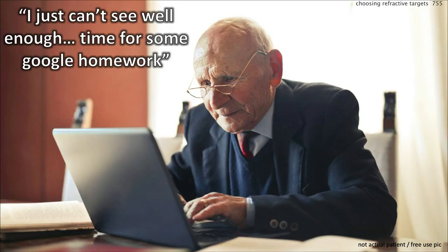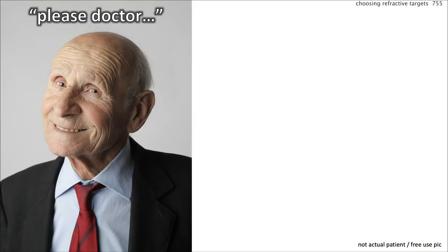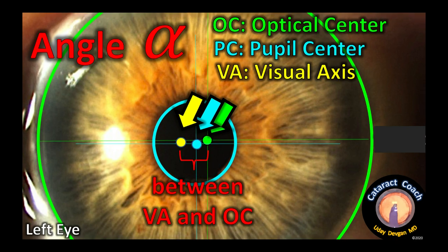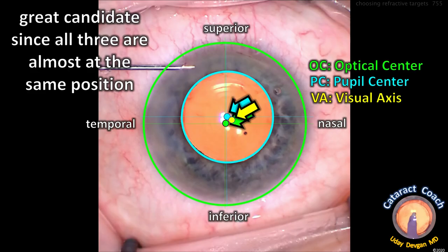Our last patient says he can't see well enough and after some Google research figures he can get perfect vision. He says he'll pay whatever it takes for absolute perfection. We under-promise, and he agrees to a diffractive trifocal lens and can live with the compromises. Importantly, let's analyze his angle alpha — the distance between the visual axis and the optical center — and even more importantly, angle kappa, the distance between the visual axis and the pupil center. You want those to be almost the same. In the first picture shown, they're too far apart; in the second, the pupil center and visual axis are nearly identical.